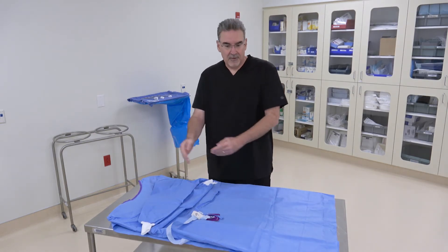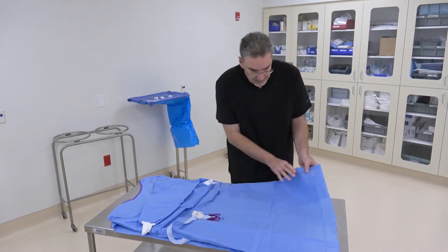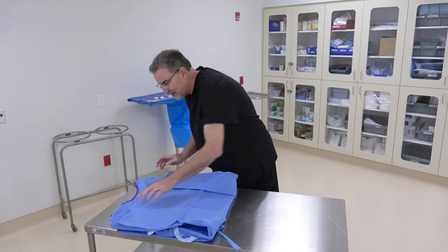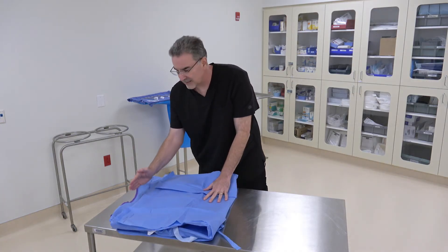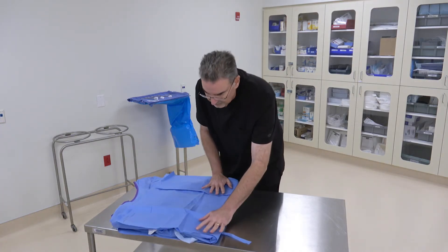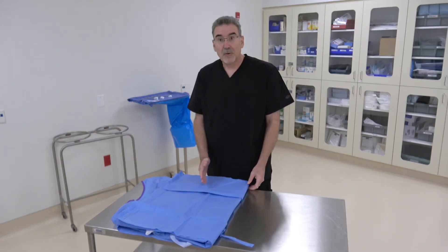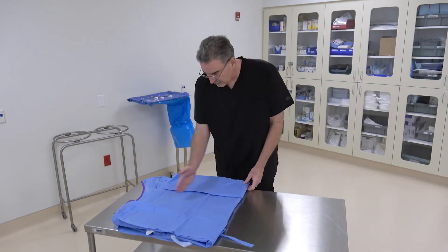With the gown nice and spread out and everything neat, fold it in half. Find about the halfway point and bring it up to just about the neckline — not quite to the neckline, but just about there. At this point, we're going to fold it into thirds.